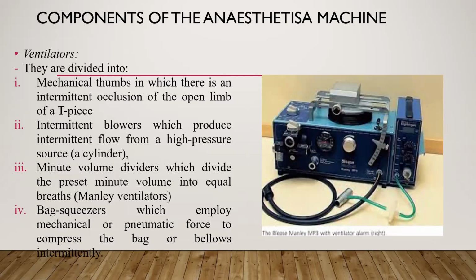Another vein is the ventilators. How many of you have seen these ventilators before? Oh my God, I have some nostalgia here. This is our very wonderful Manley ventilator. How many of you have seen this minute volume divider, the Manley ventilator? The people that have Boyle's machine should have Manley's ventilator there too. Yes, I saw it, but it's no longer working, sir. Oh my God, they should fix it.